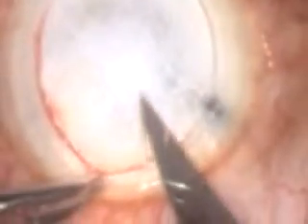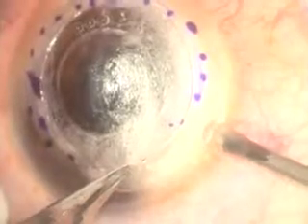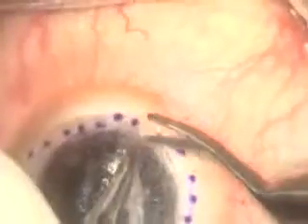Surgical technique. Carry out the trephination of the host cornea using the desired size of trephine up to the depth of 70 to 80%. Inject air using a bent 26 gauge needle into the deep stromal layers until you achieve the desired big bubble. Air injection is helpful in cases where the pathology extends to the Descemet's membrane level. Deflate the anterior chamber partially through a stab wound. In case you don't achieve a big bubble, then perform the corneal dissection layer by layer or in a spiral manner till you reach the Descemet's membrane.